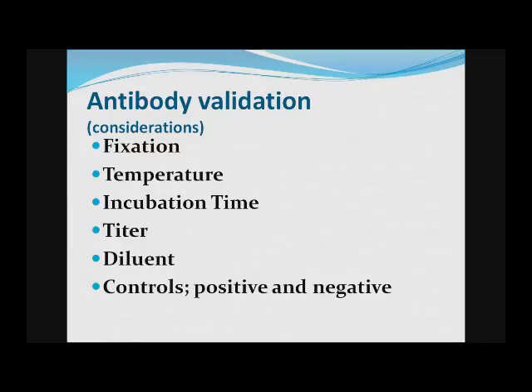This is one of the nice things that in today's world we have access to so many ready-to-use antibodies, and the manufacturers many times know what diluent keeps that antibody happy. And then when you're working up new antibodies, and even working with antibodies you've had on hand, such as BCL1, you want to use a positive and a negative control. And I'll show an example later on in this webinar of a positive and negative control.